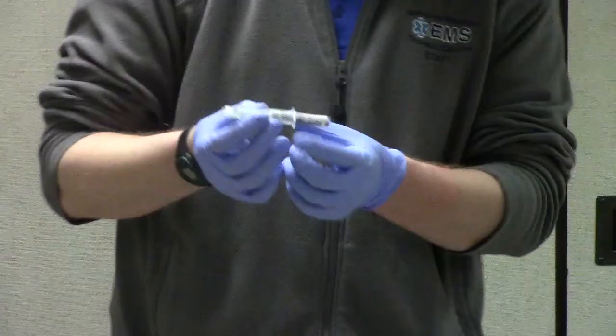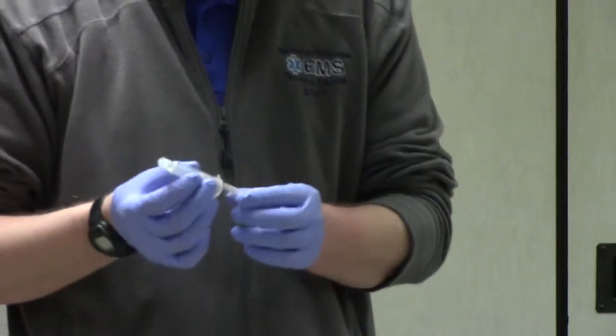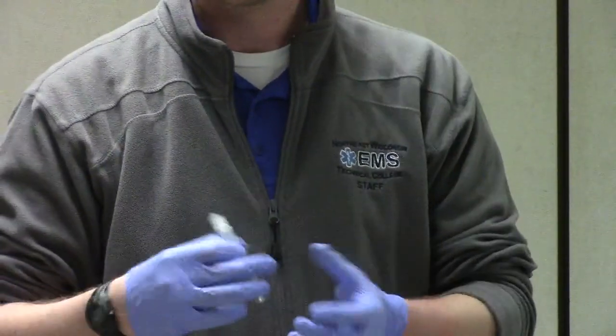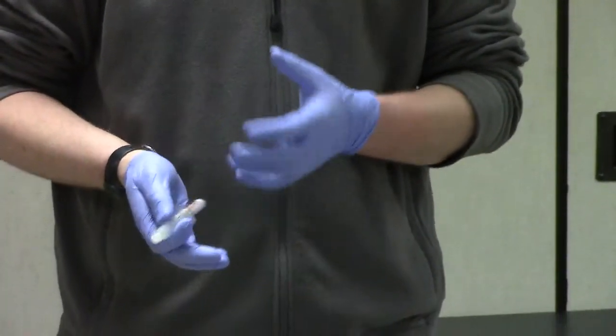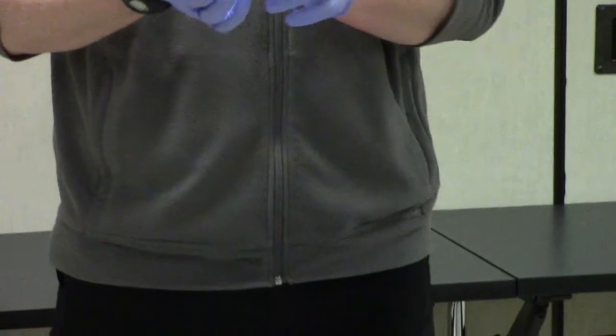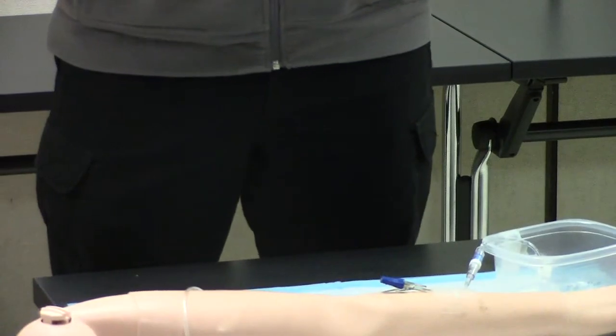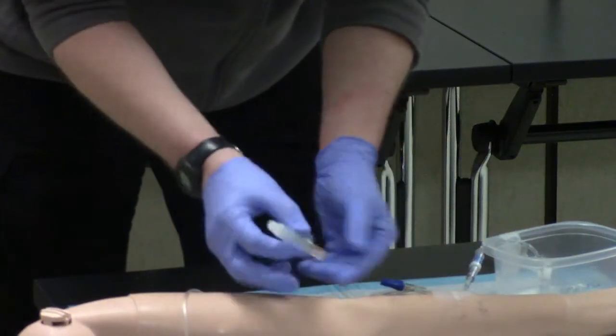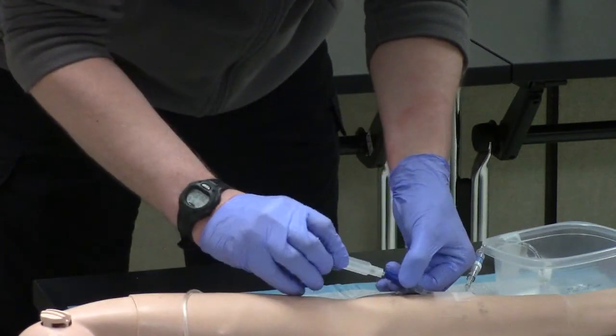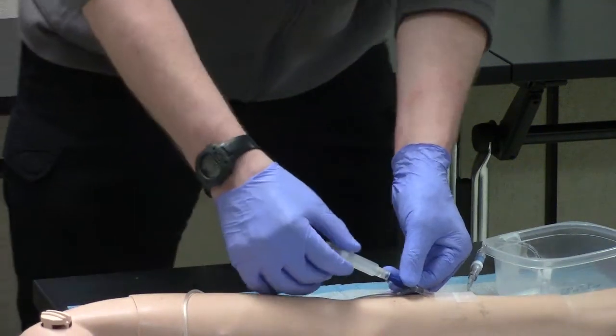Okay, I'm going to reaffirm that I do in fact have Narcan or Naloxone. Narcan is a slow push medication, so I'm going to administer it over about 15 to 30 seconds, watching for a patient response. Depending on your protocols, you may have some differentiation in the dosing. In particular, my protocols are 1 to 2 milligrams titrated to effect. I've reaffirmed that it's Narcan, so we're going to go ahead and attach it.